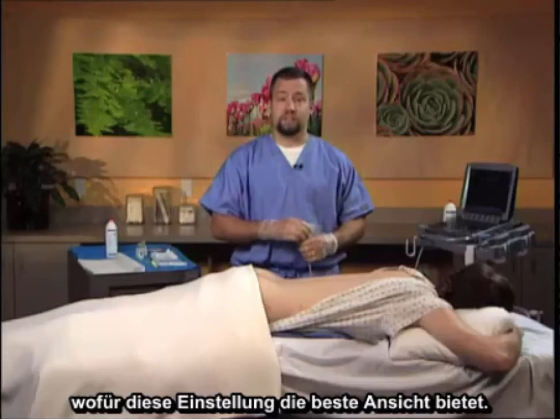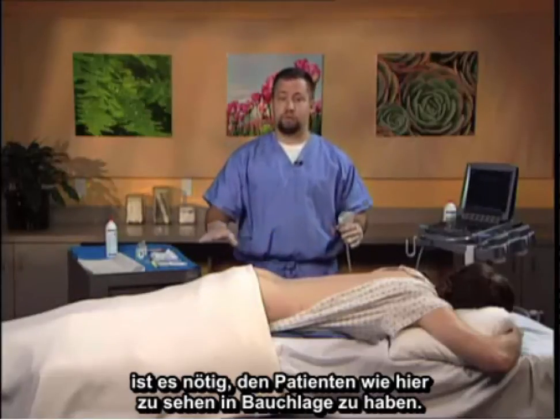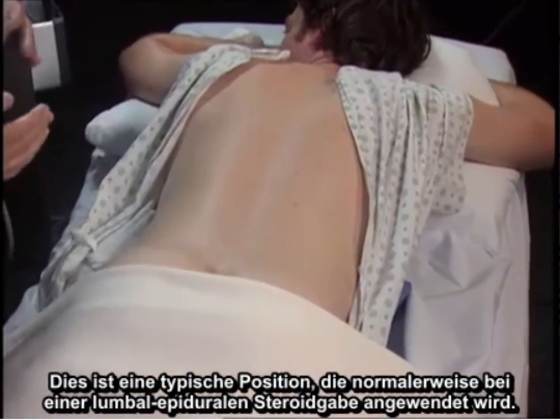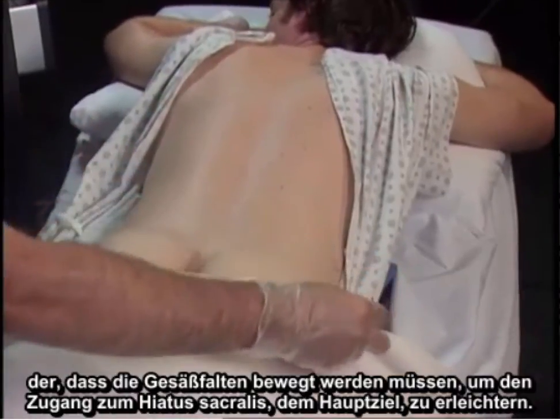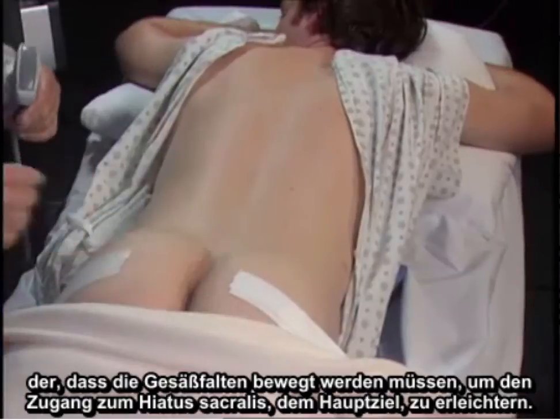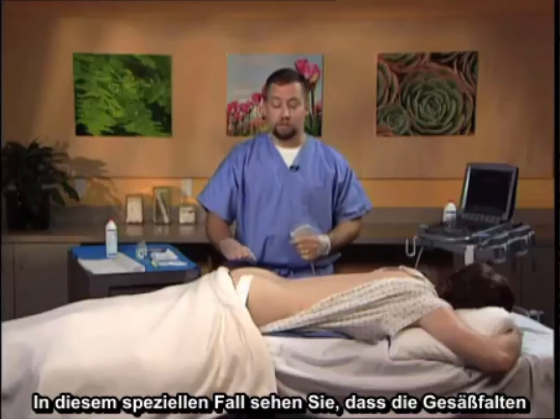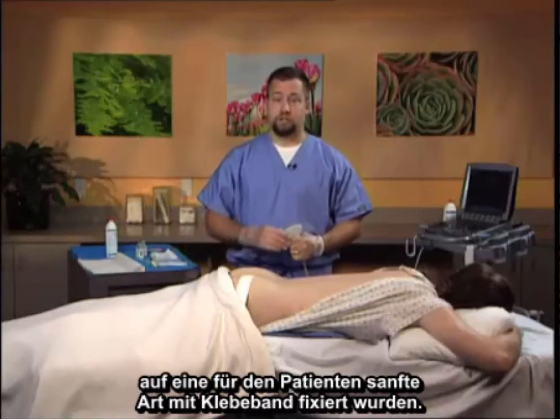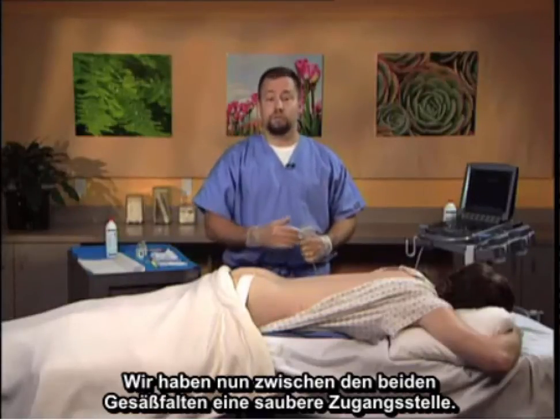In order to facilitate placement of the patient for the procedure, it is necessary to have the patient in the prone position as seen here. This is a typical position that would normally be used for a lumbar epidural steroid approach. One key difference, however, is the need to move the gluteal folds so that access to the sacral hiatus, which is the key target, is facilitated. In this particular case, you can see that the gluteal folds have been taped down and away in a caudal fashion to the patient. We now have a clean access point within the two gluteal folds.